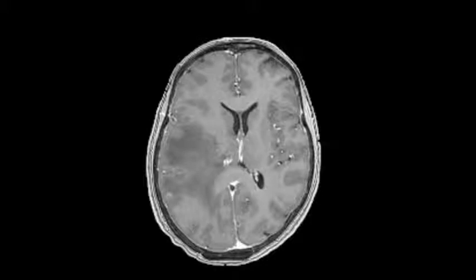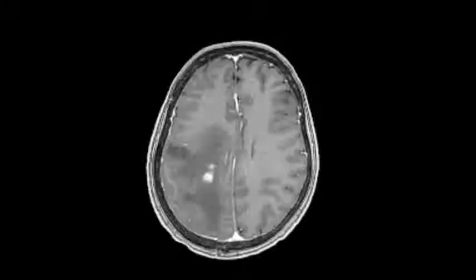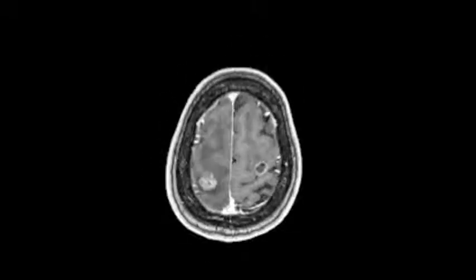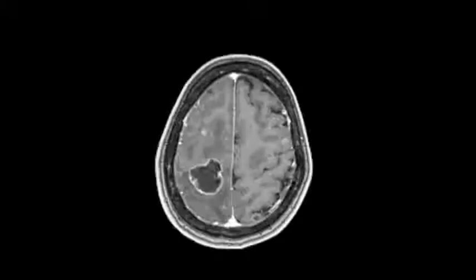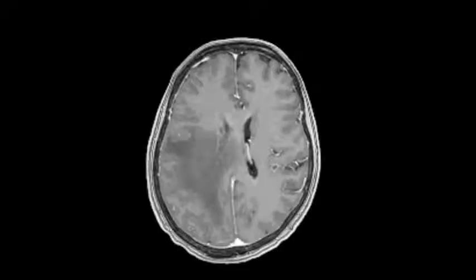A 45-year-old male presented with paresis of the right arm and leg. Imaging workup revealed a tumor in the central region of the left hemisphere. To reveal how close the tumor was to the motor cortex, mapping with Navigated Brain Stimulation was performed.